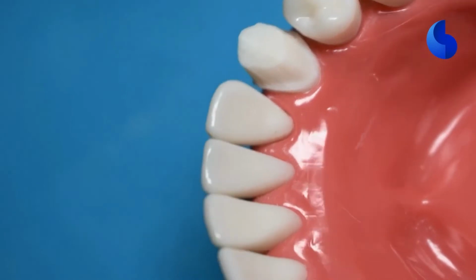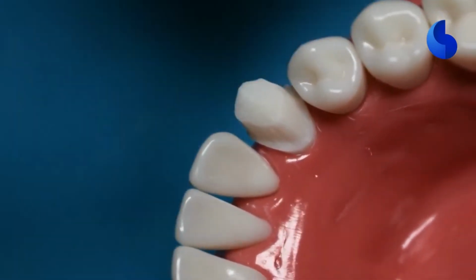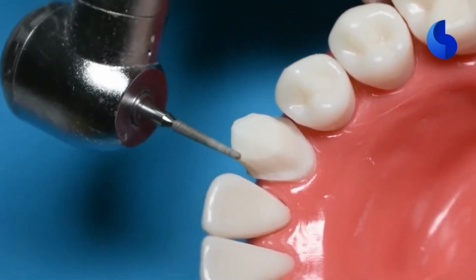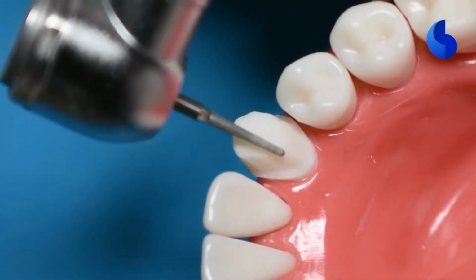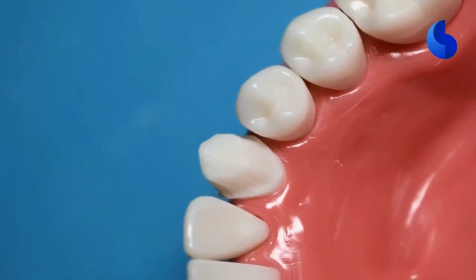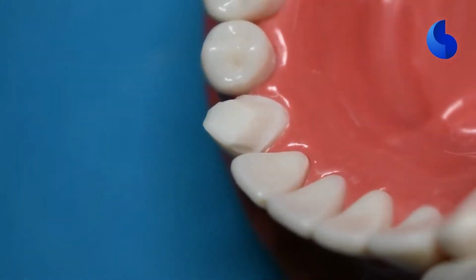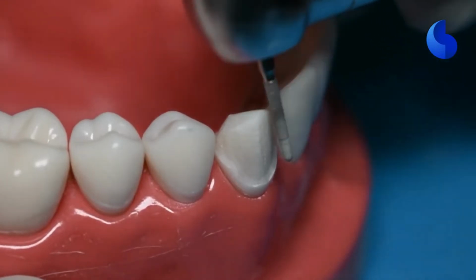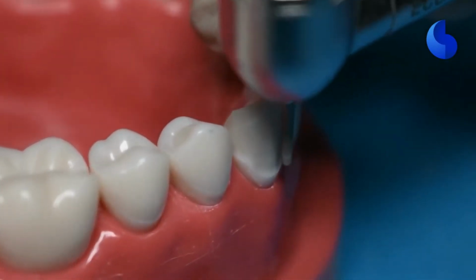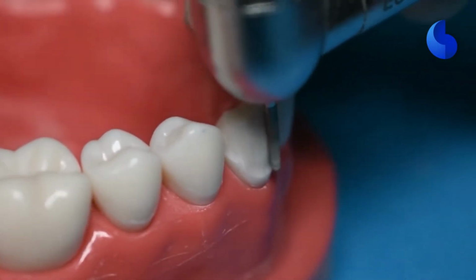You could use depth orientation grooves on the lingual surface as well. Right now what we did was just a planar reduction, where we are kind of eyeballing the preparation and trying to see if we are achieving the width we're looking for. An 856-016 burr has a diameter of 1.6 millimeters right at its tip. So the more you practice, you will kind of realize how much you're preparing, or you can also use a periodontal probe to measure that.